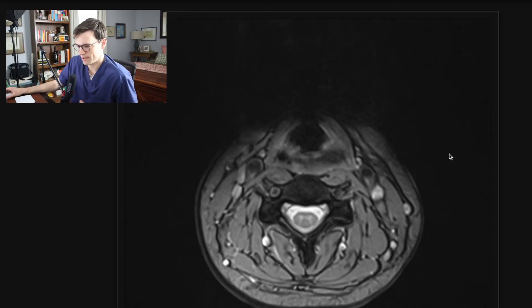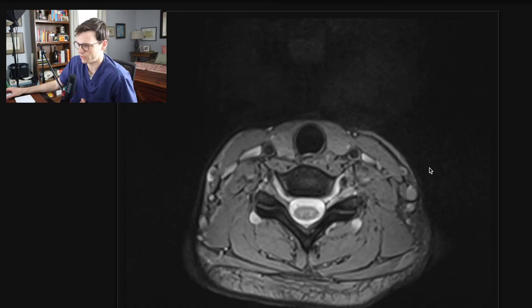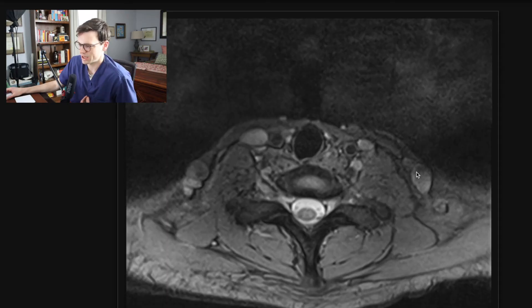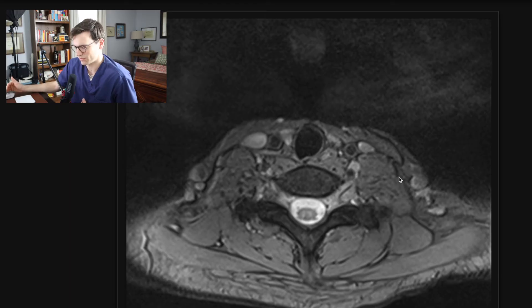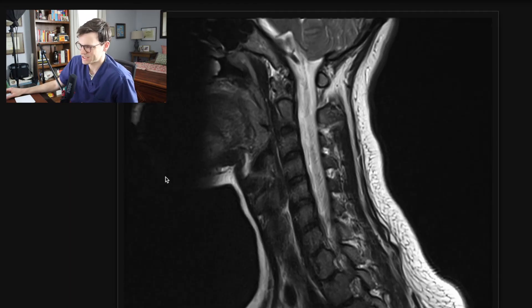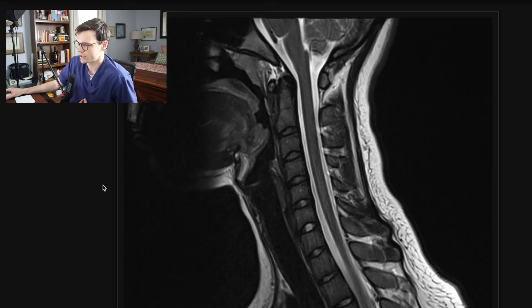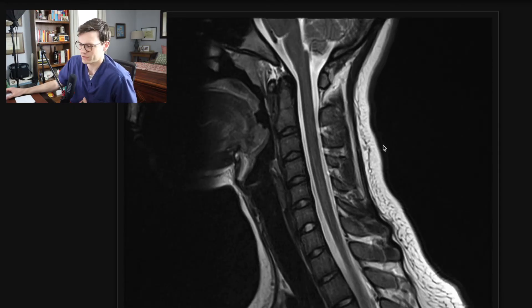I go down and back up looking at every single neural foramen at every level. In this case they're all wide open, so this is a good example of patent neural foramen. Once you have an idea of what un-stenosed foramen look like, you can then get an idea of what mild, moderate, and severe stenosis looks like. I then go back to my sagittal and look at the canal — your canal is here, and just make sure there's a healthy amount of CSF surrounding the cord. This is a sagittal image depicting a very wide open, patent spinal canal.